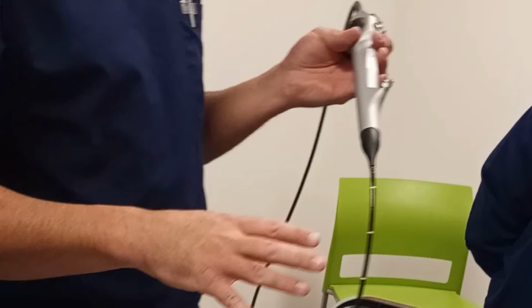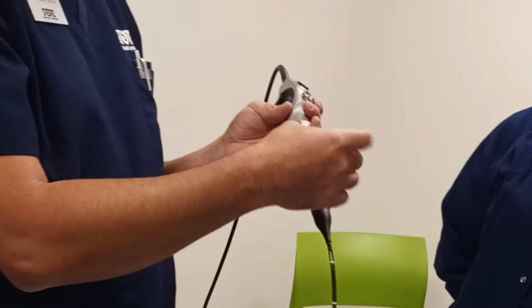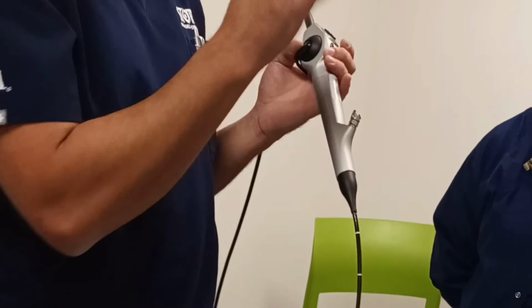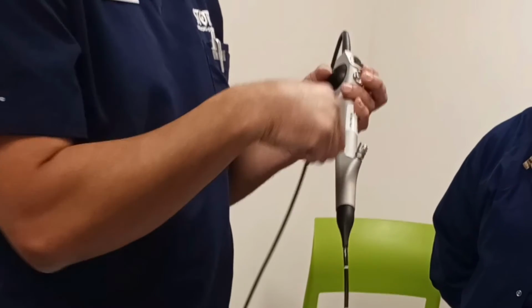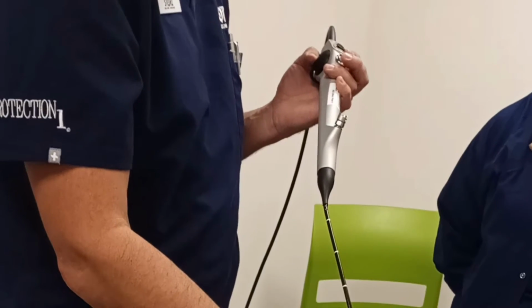Once we wipe off the exterior, we've got all that debris off, and you have your caps on there. You're going to take the appropriate size brush and stick it down the channels of the scope. You're going to follow it all the way until it comes out of the distal tip of the scope.